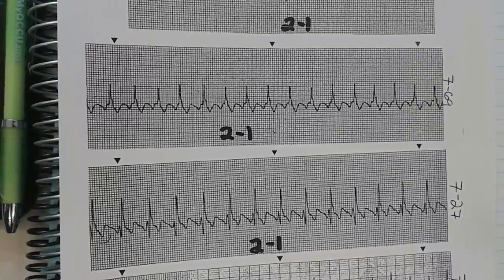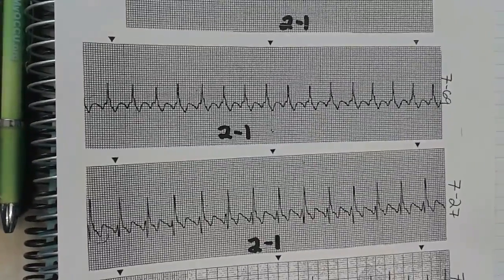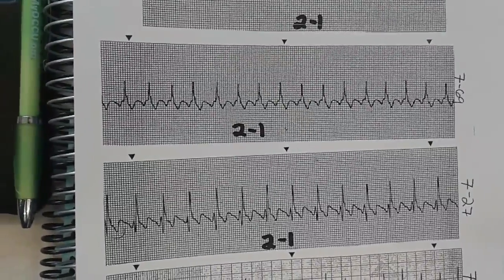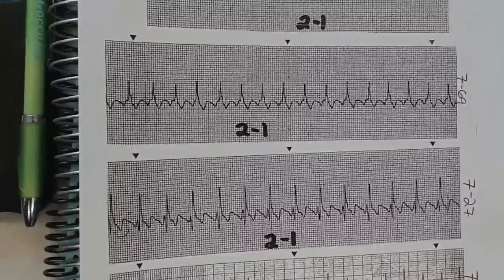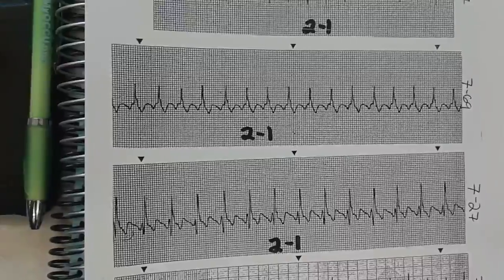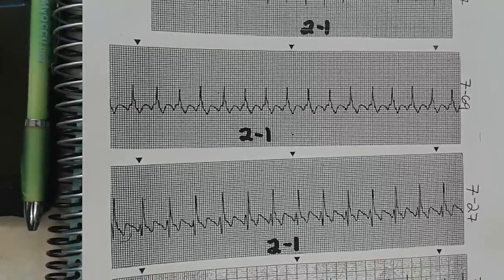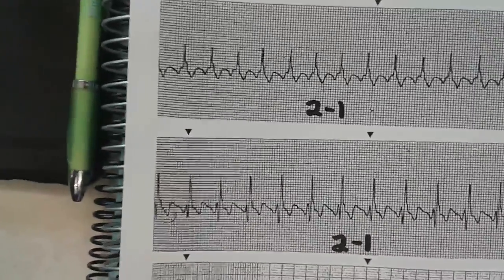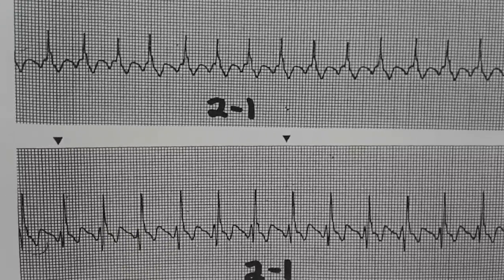So we will have a very difficult time actually measuring and finding out exactly what's happening with the QRS complexes, because it does look wider than normal in that particular one. Well, where is the isoelectric line? It's a great question. We can't actually determine exactly where that isoelectric line is, because there's never a time where there is an isoelectric line. We don't know if these F waves are truly negative, truly positive, or very biphasic. We can't really tell. That makes a lot of things very difficult.